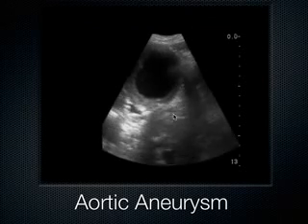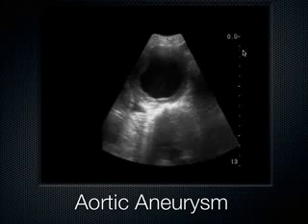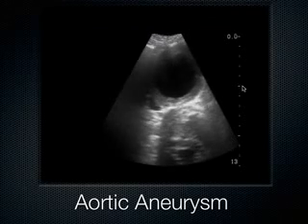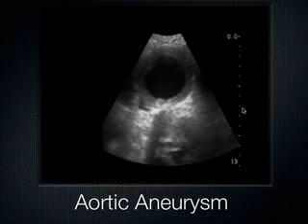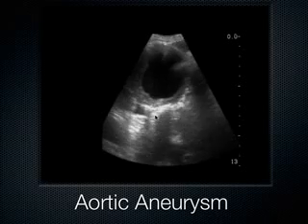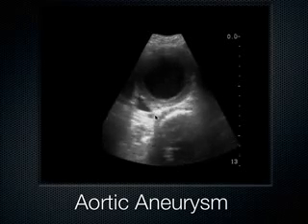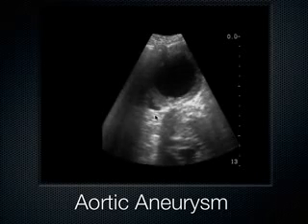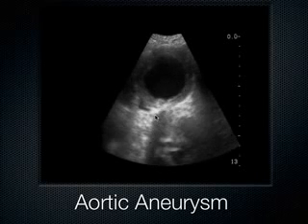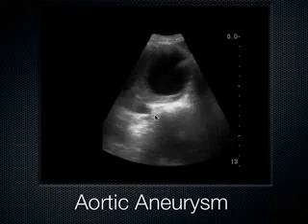So here's our spine shadow, and then this is an aneurysm over here. And you can just kind of eyeball it, like 1, 2, 3, 4, 5, maybe one more, 6 centimeters if I had to come across to here. And in fact, for the normal ones, I don't even stop and measure them anymore. I just look over at the side of the screen and go, oh, they're less than 2. Everybody's aorta in this room right now is less than 2 centimeters. And so it doesn't make sense to stop and drag the calipers over it and measure it exactly right, unless it looks large.